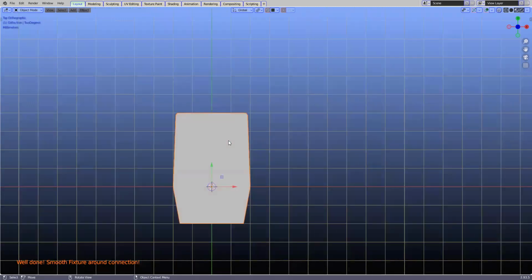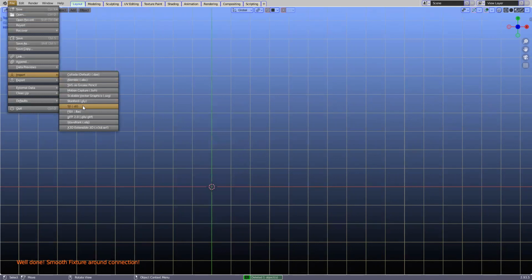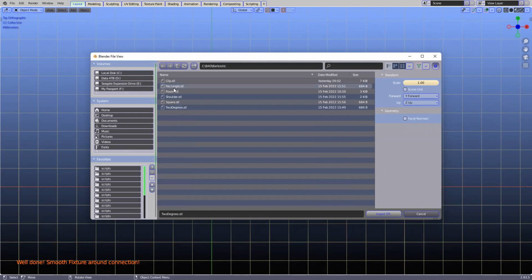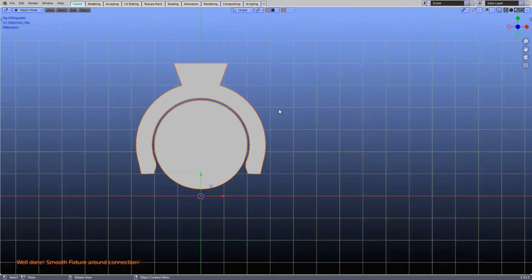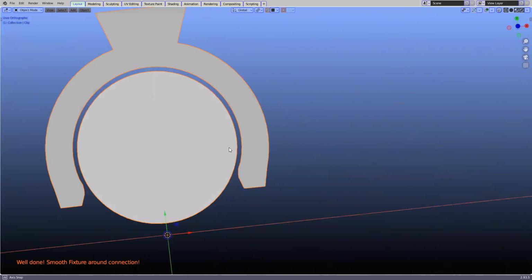And just to show you a little bit of a more complex structure, here's one with a clip. So we've got a round circle with a clip around it. Now, this hasn't been tested yet, but we are about to test, and we're very excited with this actual design.